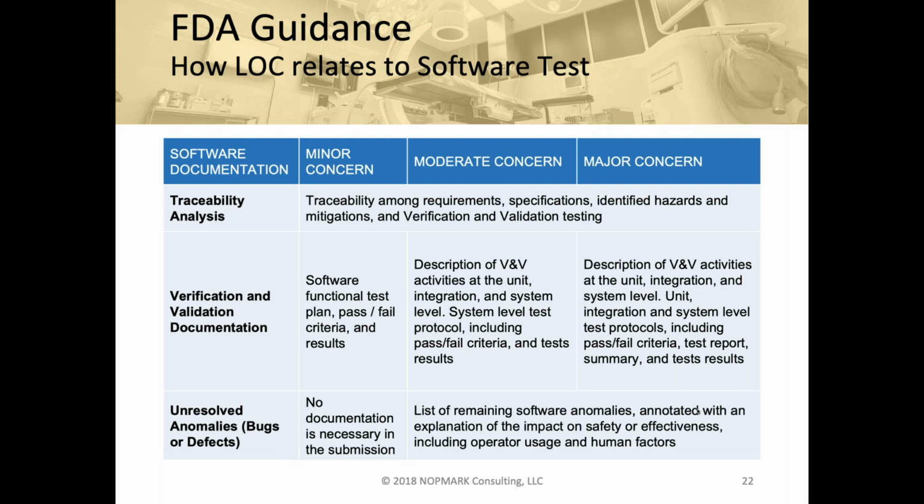If you look at that middle row, this is the biggest one for software testers. When our level of concern is minor, our testing itself, even at the software system level, becomes simple. It's much higher-level functional tests. There's less objective evidence we need, so our expected results are less prescriptive, and our reporting is simpler.